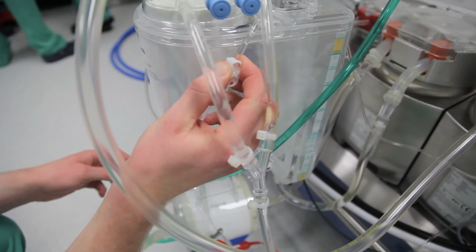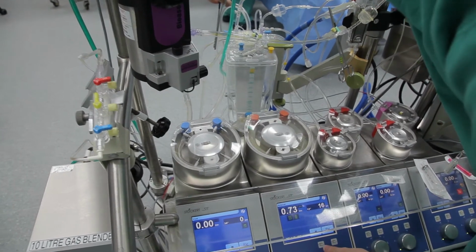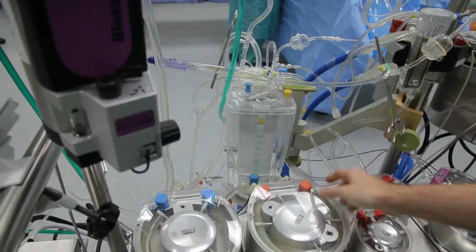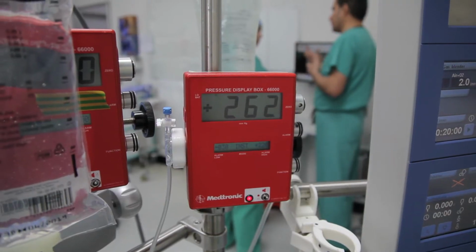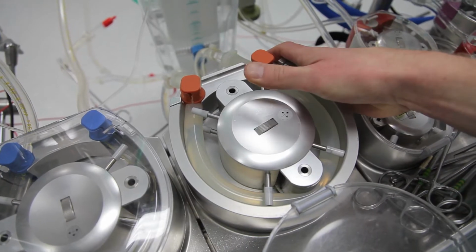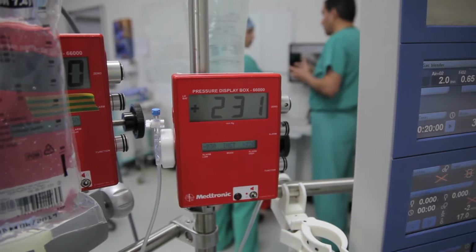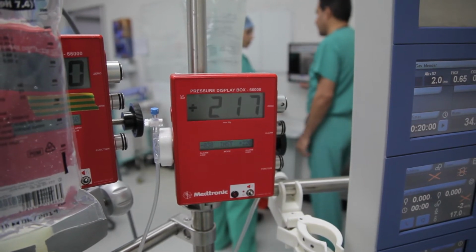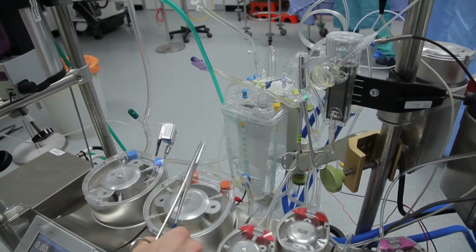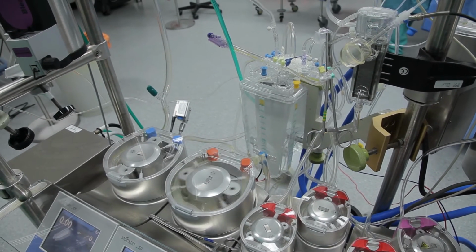Oxygenator purge line. Clip off that. Now I need to set the occlusion on the pump. So the way we do it is clamp the recirculation line, turn the pump by hand, bring the pressure down to around 220mm of mercury, as that will be a typical line pressure on bypass. Then we aim for around 1mm of mercury drop per second. There you go, that's dropping fast enough there. So set circulating again. So that is the oxygenator and pump boot all primed.